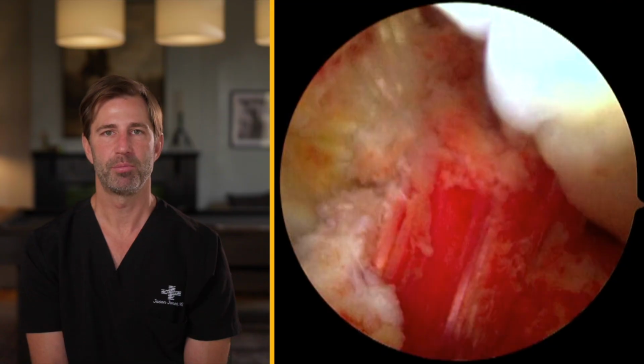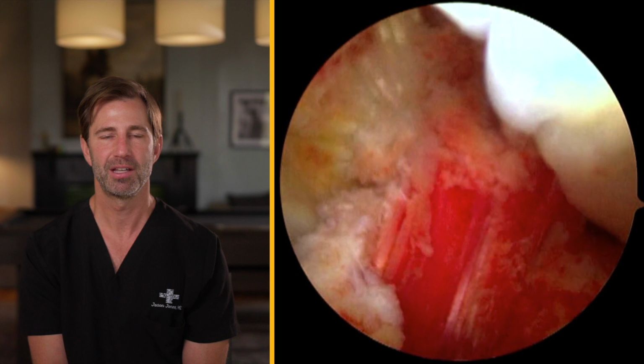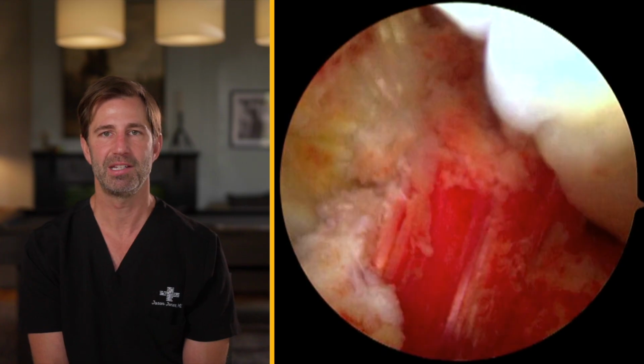At this point, we've completely reconstructed the ACL. You could see the new ACL ligament in the center portion of the knee. We will test this by flexing the patient's knee to 30 degrees and providing an anterior force on the lower bone, which is the tibia. We want to see the ACL catch and hold the lower bone firmly in place. We also want to see the knee in extension to have the ACL at full tightness. As we flex the knee, the ACL becomes slightly more lax, and this correlates with the normal anatomy of the patient's anterior cruciate ligament.